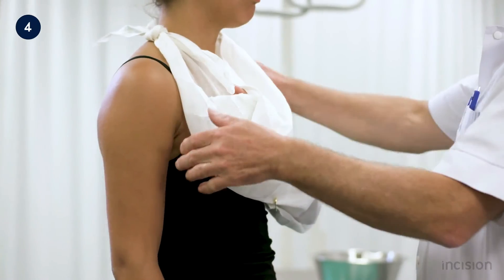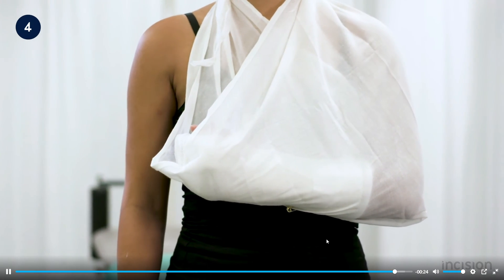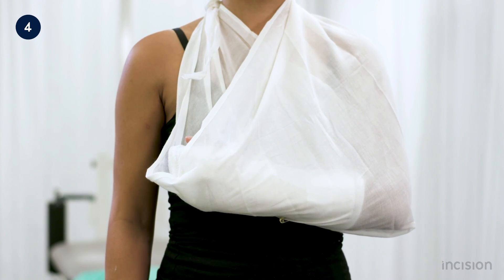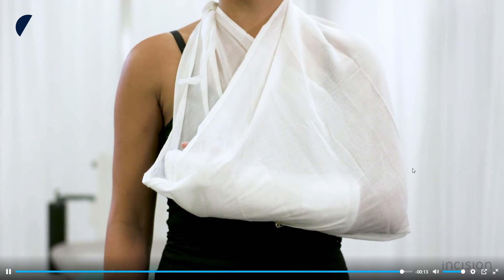The application of the splint is now completed. Note the hand's elevated position in relation to the elbow, which prevents swelling of the hand and forearm. Be aware that a triangular bandage is preferred over a sling, as a sling carries the risk of causing pressure complications by indentations in the plaster.